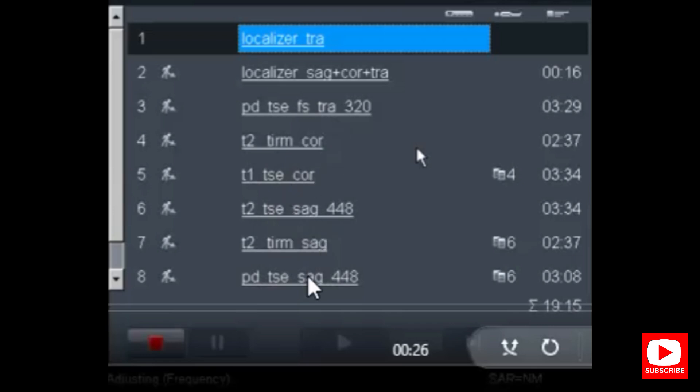If you want an additional protocol for ligaments, you can take a T2 coronal oblique or T2 sagittal oblique. You can take this — no problem.